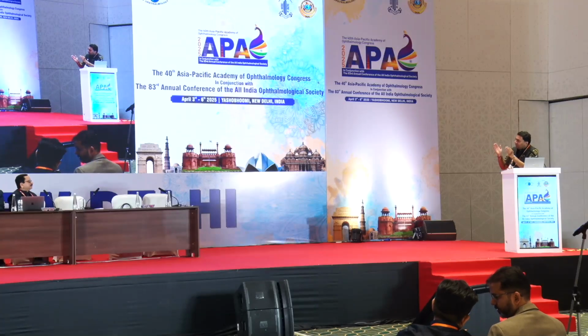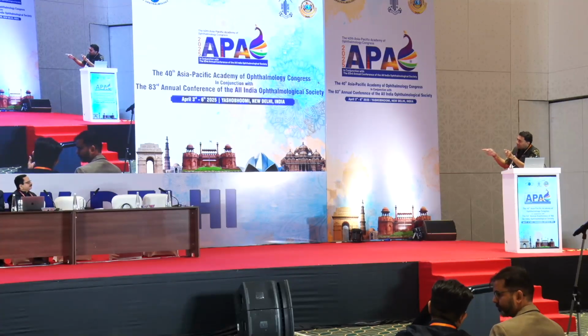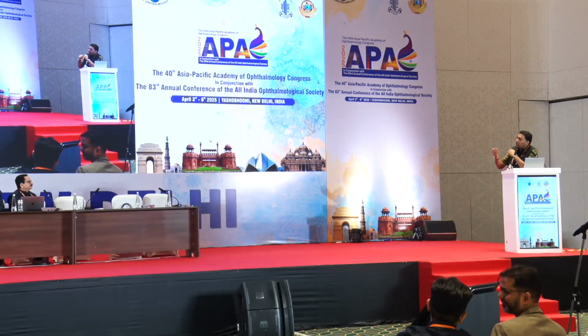It also looks at how much the lens is contributing and how you're balancing the aberration. So AI will decide how much aberration I should actually correct, both from the cornea and the lens, so that I don't create an imbalance between them. The whole challenge with Contoura, why we were not getting more gains, is that you create a good corneal aberration-free zone, but your lens aberrations are not balanced. In ray tracing, because it's forward ray tracing, you look at everything. It also knows how much the lens is compensating and how much the lens is adding. So you get a complete picture compared to a non-complete one.